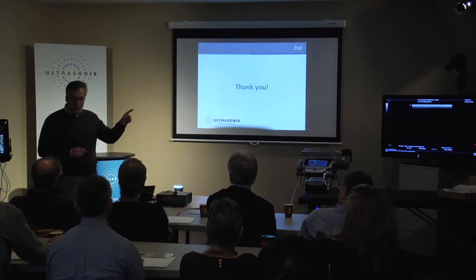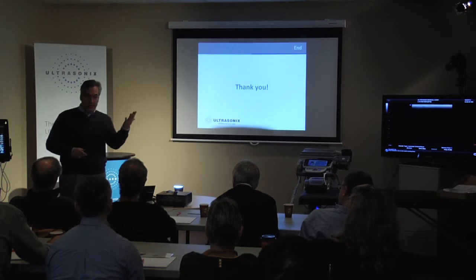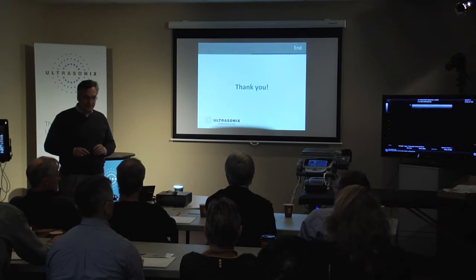Or you can go into presets, find your name or whatever label that you've chosen as a definition of that procedural identification, hit it, and the system automatically comes up with your defined choices. Your image, your depth, your focal, your frequency, your gain, your maps, your dynamic range. Short of that, what's chosen?